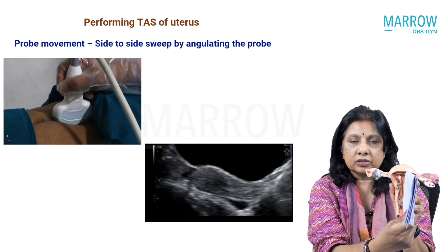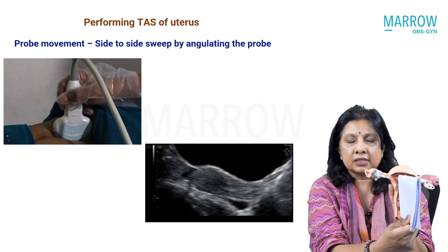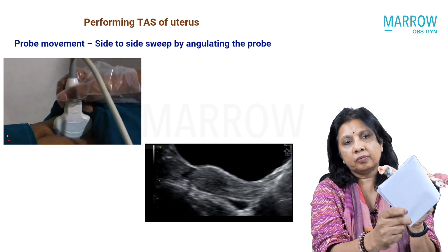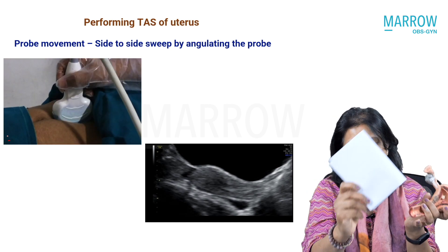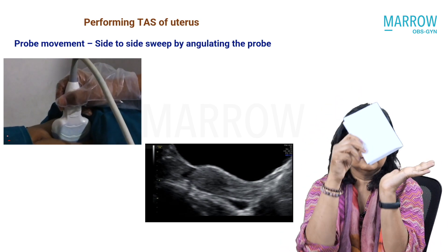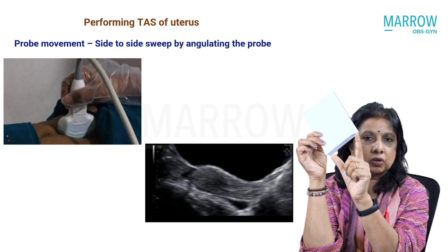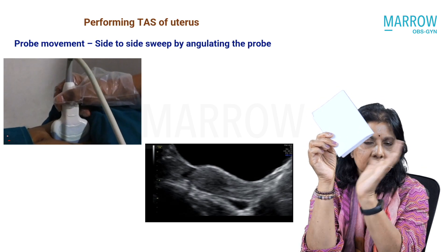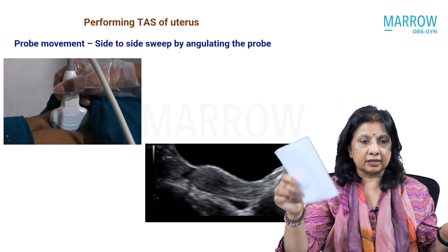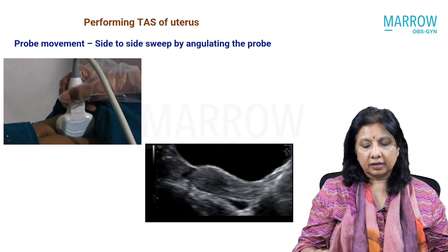But because the uterus is so small, I really don't slide it. I do a side-to-side movement by angulating the probe. Now why do I call this movement angulation? Because if this is the abdomen and this is my probe, I am moving on what is called the broad axis of the probe. So because I'm moving on the broad axis, I'm calling it angulating. This is the movement that you see in the top left clip.